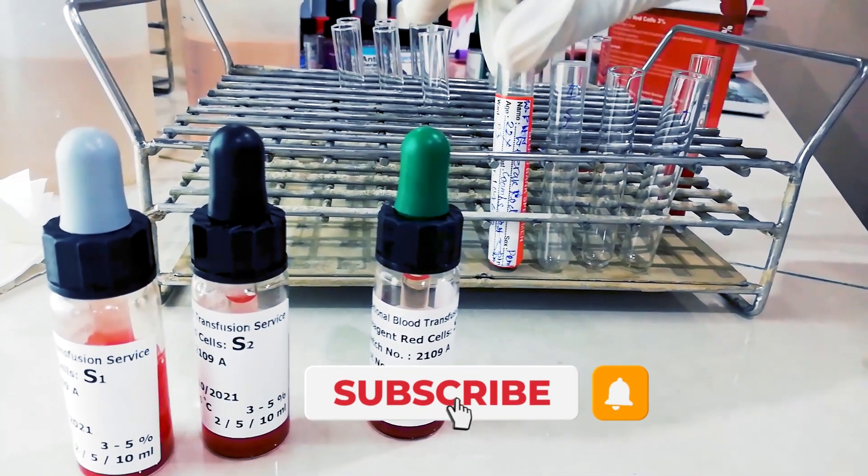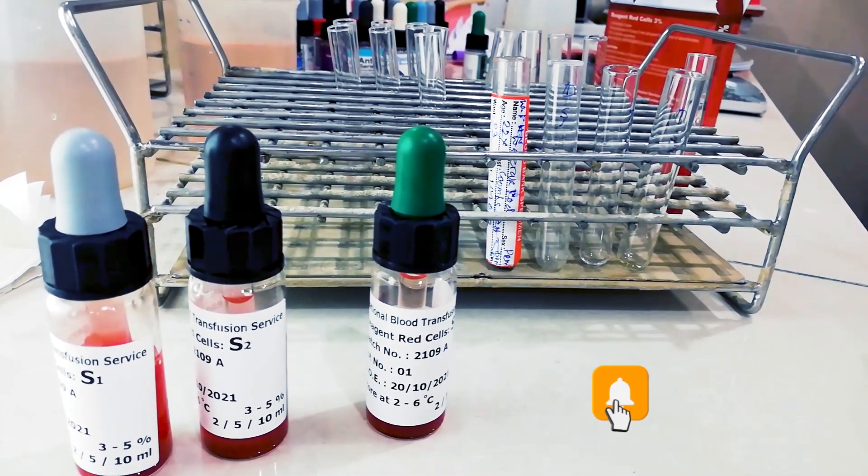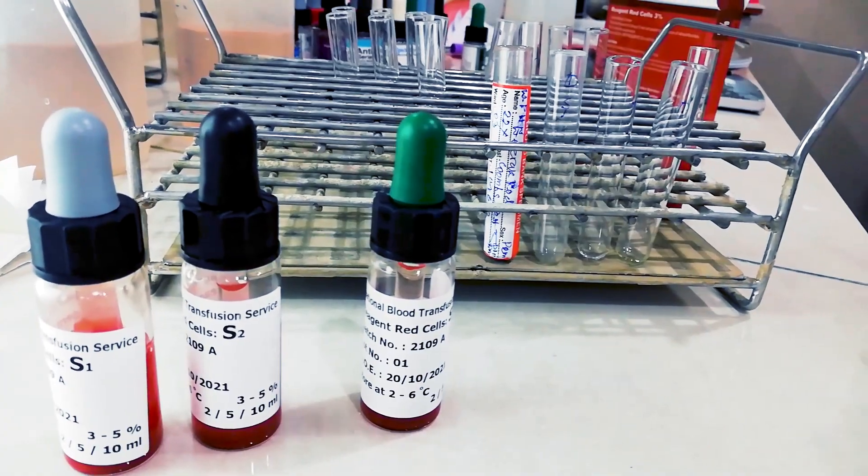For that, we have to centrifuge the blood sample up to 4000 rpm for 1 minute.